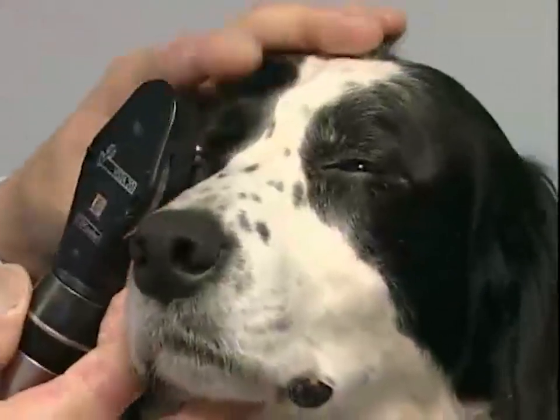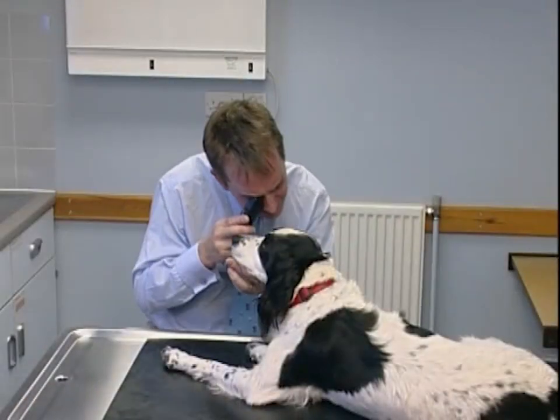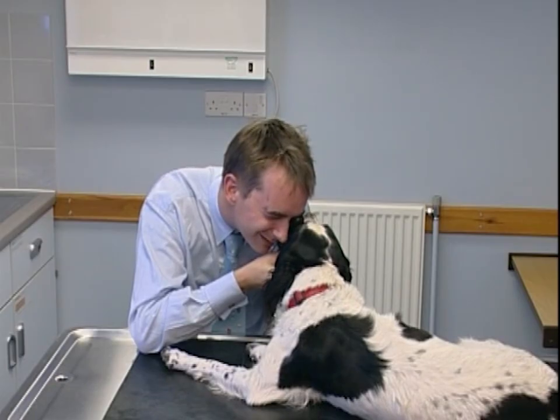Alternatively, the ophthalmoscope can be placed in close proximity to the globe, and then the observer looks through it. Either way will work correctly. However, it is important to remember to use the examiner's right eye for the patient's right eye and the examiner's left eye for the patient's left eye.